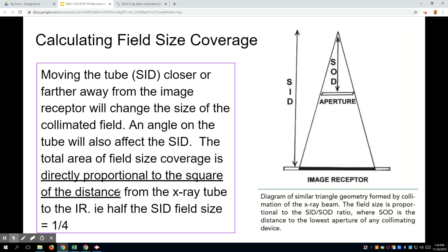If you have collimation on one side but not the exact opposite side, so I'm talking about you have collimation here but not here, I'm not talking about the top and the bottom, that means your alignment is off. That's a telltale sign. I mean, is it possible that your collimator is broken? That's doubtful. Most likely it's the alignment.